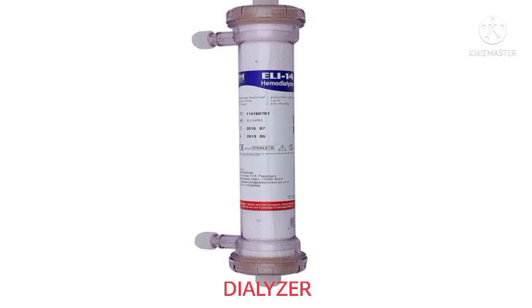Blood delivery system: the blood pump moves blood from the access site to the dialyzer and back to the patient. Blood flow rate is 250-500 ml/min.